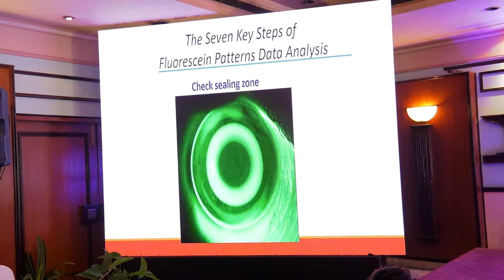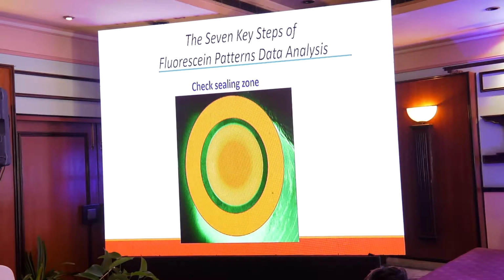So the next thing you look at is the sealing zone. The sealing zone is the end of the first reverse curve, this point of the lens. This should be aligned to the cornea. When you have that zone aligned to the cornea, so you can see no green there, so dark, then the lens is perfectly fit. If you do not have proper alignment there, you will not have good treatment. So you need to align very well there. Flattening the periphery, making toric zones, and so on. There are more complex things to do there. But basically, the sealing zone is that point. Now, that's the pressure, negative, positive pressure on the lens.